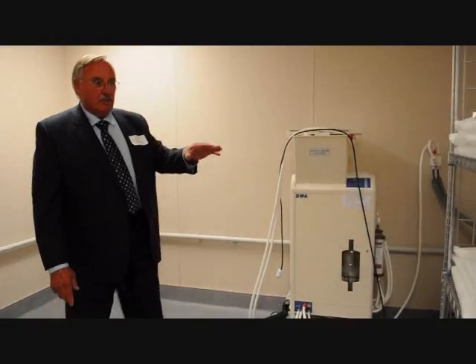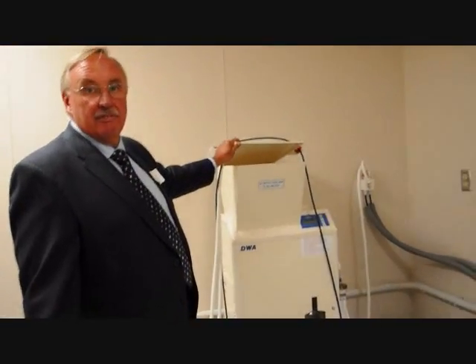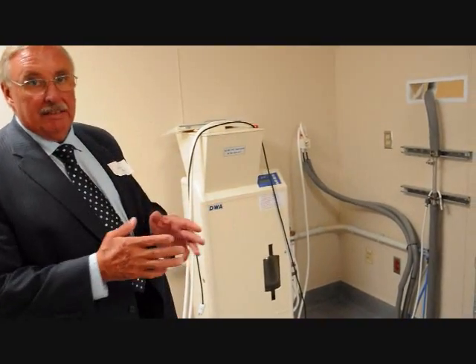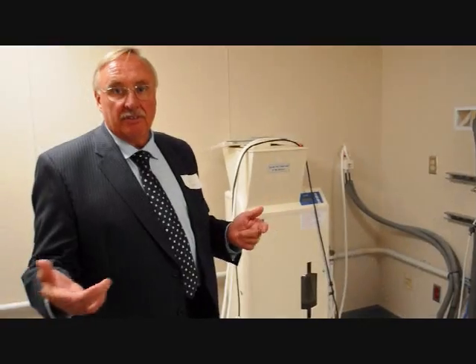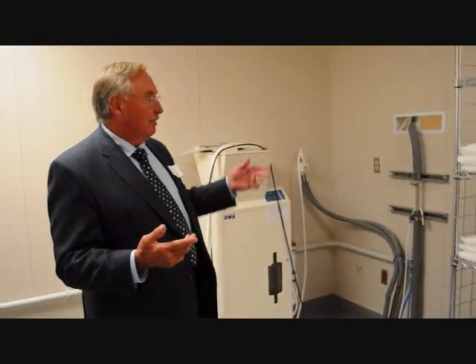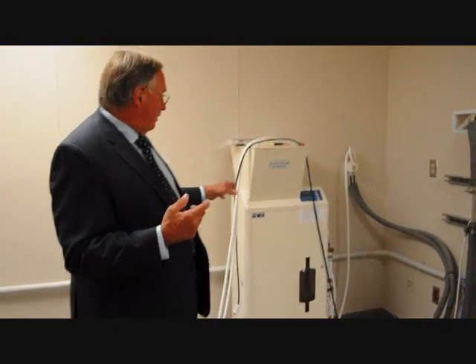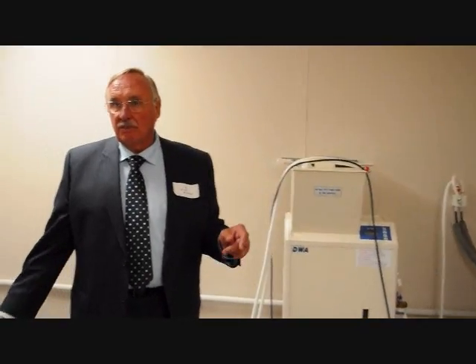This machine takes the dry bicarbonate, which is on the rack, and you put it in the hopper on the top of the machine. And after you put it in the hopper, it mixes with ultra-pure water from the water system we just saw. Mixes in the tank in the bottom, and then is maintained at an exact level and an exact requirement, so that you're not making too much water. So you're only making the water or the bicarbonate that you need. And then it's transported out and around to each one of the bed heads again. Back here. And this machine is also sanitized every night with 90 degree C water to maintain the integrity of the zero bacteria.